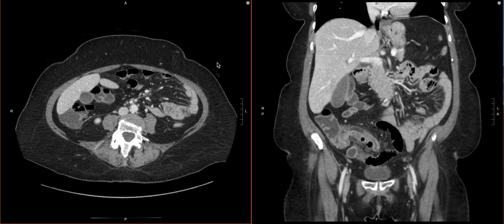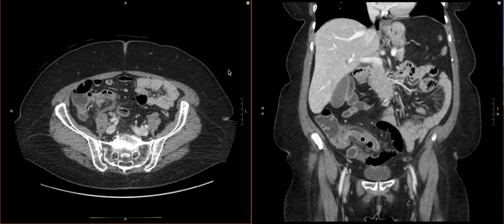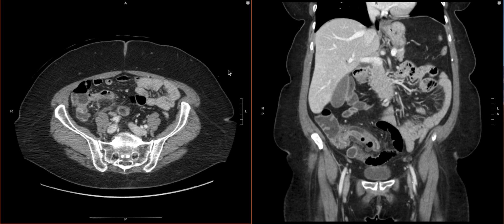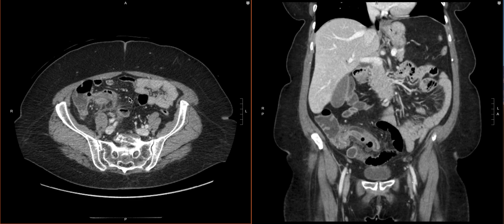We're going to go over one of the cases of perforated appendicitis on CT here. We have our axial and our coronal here. Just to be systematic, we'll be quick with how we do this, but we will be algorithmic.